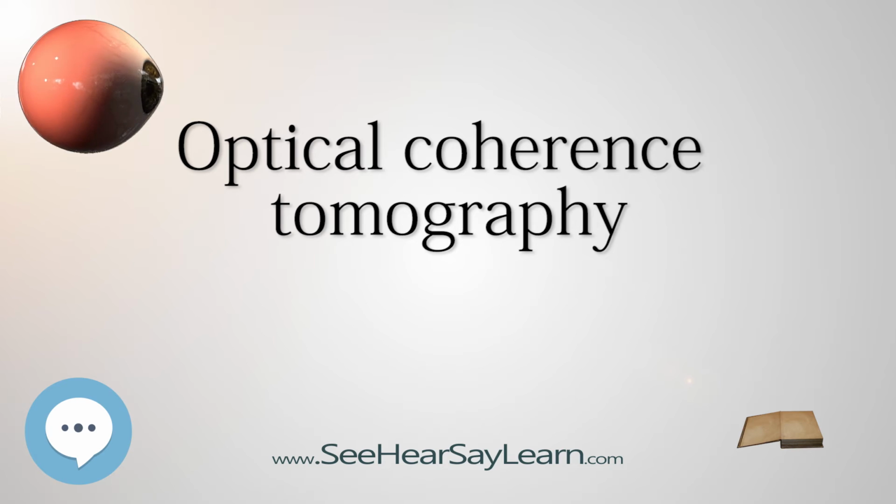An optical beam is directed at the tissue, and a small portion of this light that reflects from subsurface features is collected. Note that most light is not reflected but, rather, scatters off at large angles. In conventional imaging, this diffusely scattered light contributes background that obscures an image. However, in OCT, a technique called interferometry is used to record the optical path length of received photons, allowing rejection of most photons that scatter multiple times before detection. Thus OCT can build up clear 3D images of thick samples by rejecting background signal while collecting light directly reflected from surfaces of interest.